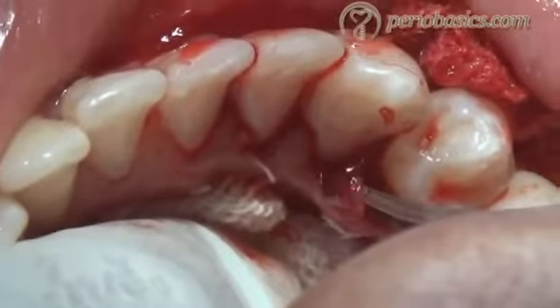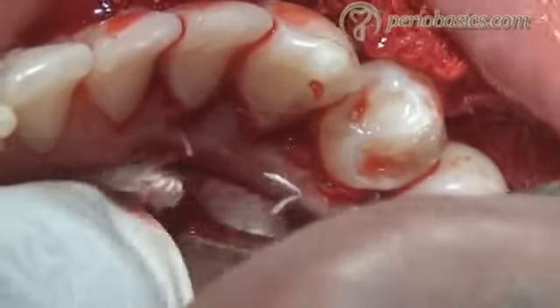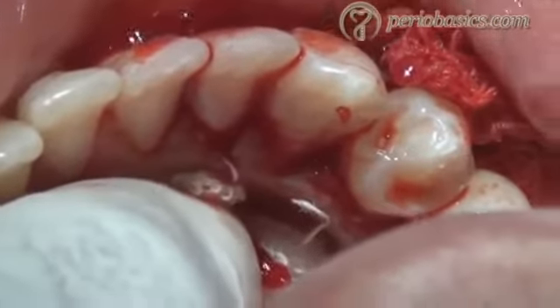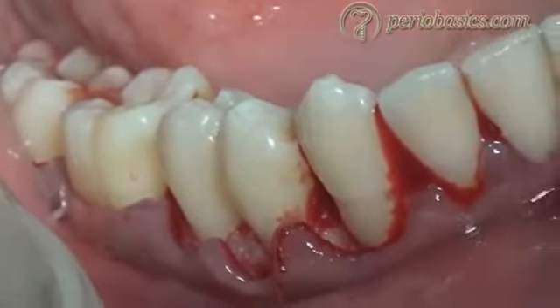And the same procedure is repeated on the lingual aspect, removing all the granulation tissue and tissue tags so that our flaps are absolutely neat and clean.